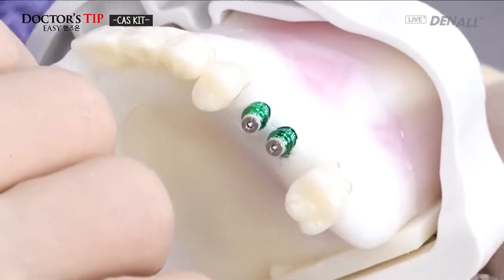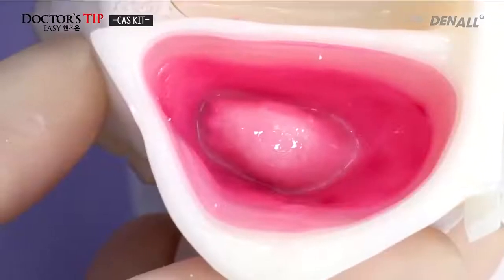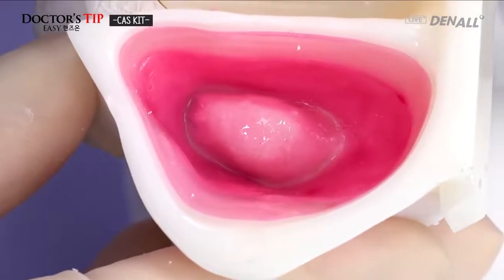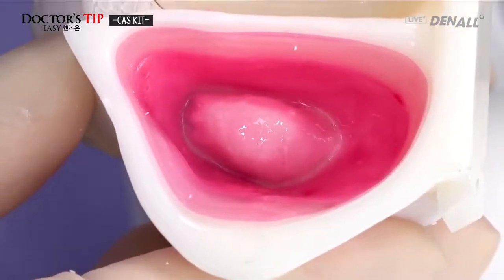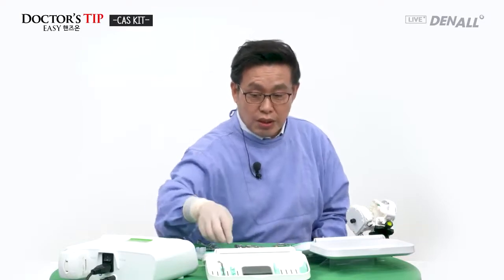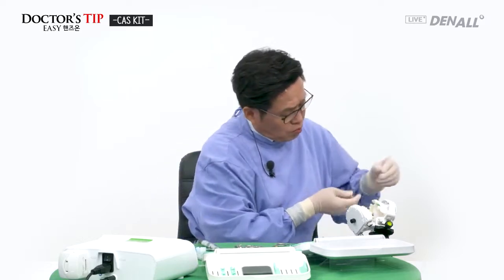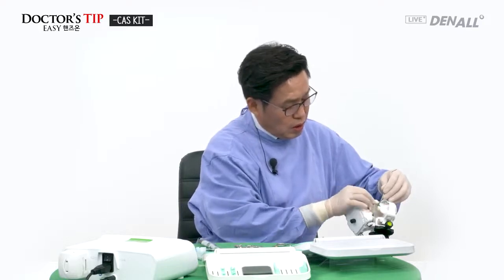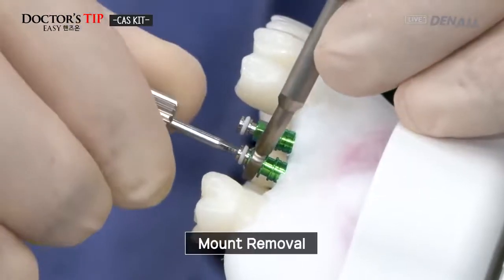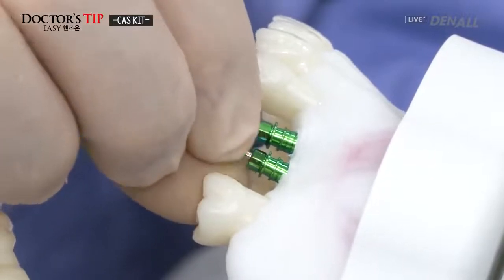Let's have a look at the inside of the sinus by removing this. This is the model. As you can see, bone materials entered into the sinus. Sinus membrane is lifted. As you can see in the sinus model, here the pre-mount is to be removed using the open wrench. The stability is good enough, so it doesn't matter, but I'm using the open wrench to hold it. A 1.2 driver is used to remove the mount. Next, it is removed by hand.